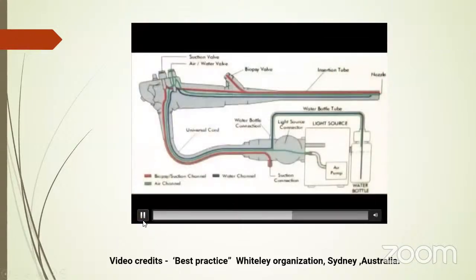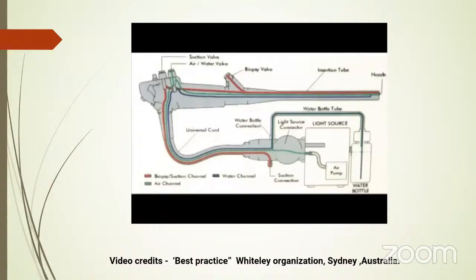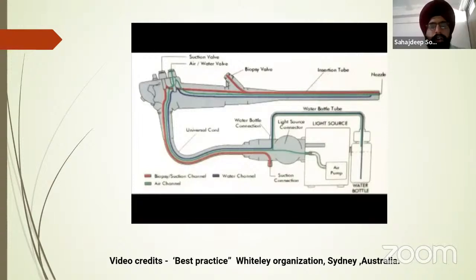Just a small question. You are showing the leak testing. Is leak testing really relevant to disinfection or sterilization, or does it have more to do with the integrity or damage of the flexible endoscope? Yes, sir, it is basically done for flexible endoscopes. The basic issue is to prevent damage to the endoscope by the disinfectant. That is why it is discussed here, so that during any disinfection procedure, the flexible endoscope has to be tested before immersion into the chemical sterilant.